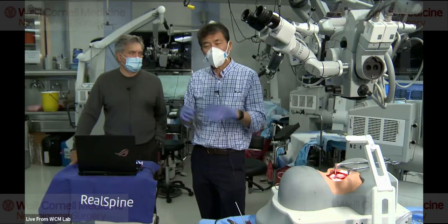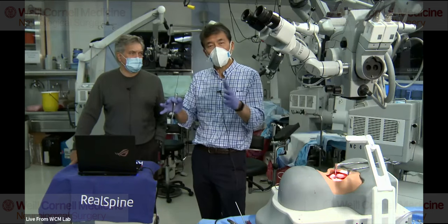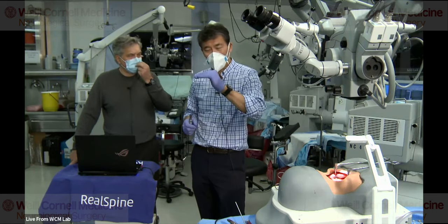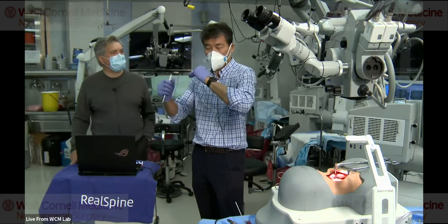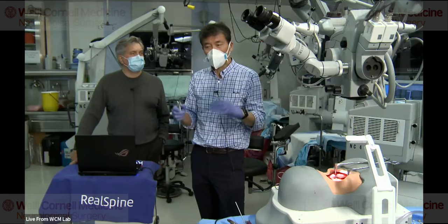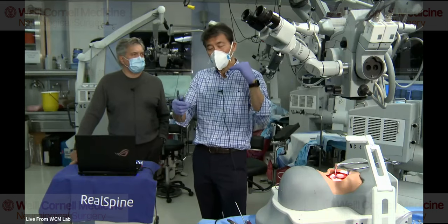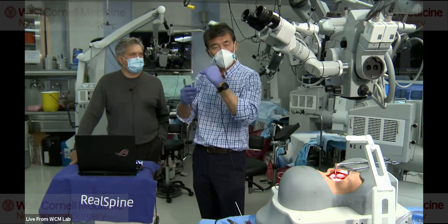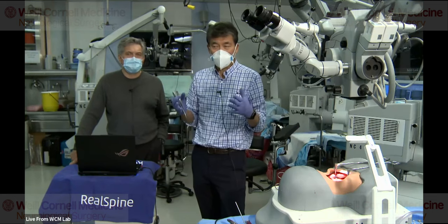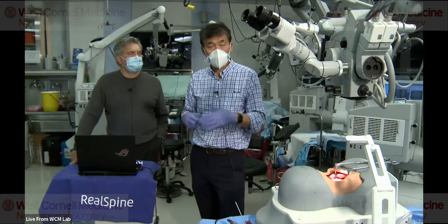And the other thing, a guy named Taguchi reported that it's better to do a C3 laminectomy as opposed to a laminoplasty. And the reason is that if you do a laminoplasty of C3, it butts up against the big spinous process of C2. So by doing a laminectomy of C3, and then laminoplasty of say 4, 5, 6, you don't have the laminoplasty where you've hinged it up, hitting the spinous process of C2. Also, when you have to do a laminoplasty of C3, you've got to dissect a lot of the muscles off of the C2 spinous process and lamina.